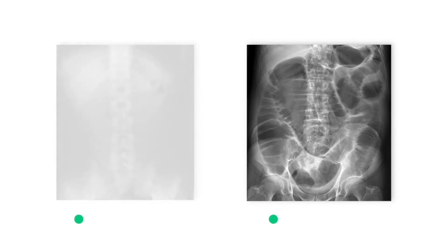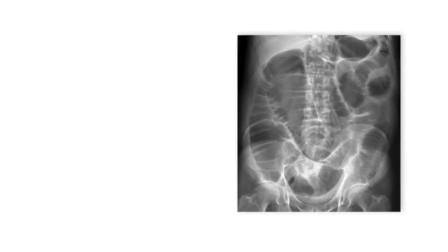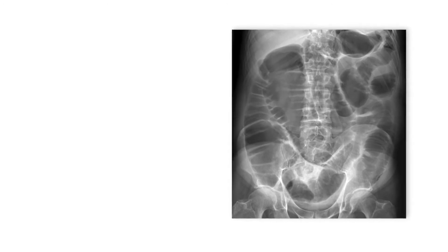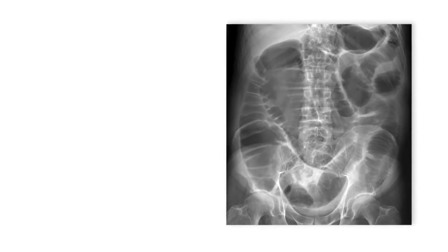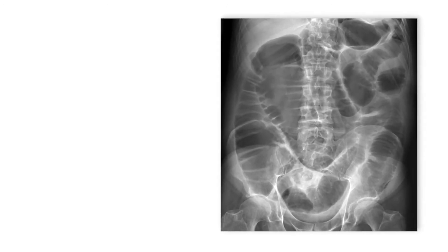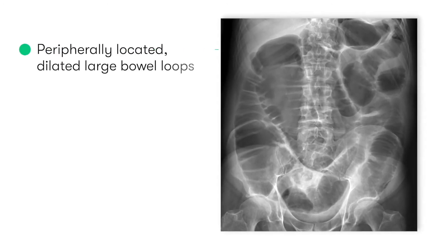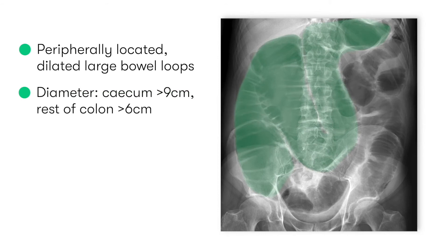Looking more closely, the features we'd normally expect to see on abdominal x-rays of large bowel obstruction are peripherally located dilated large bowel loops, with a diameter of more than nine centimetres for the cecum and more than six centimetres for the other parts of the large bowel.